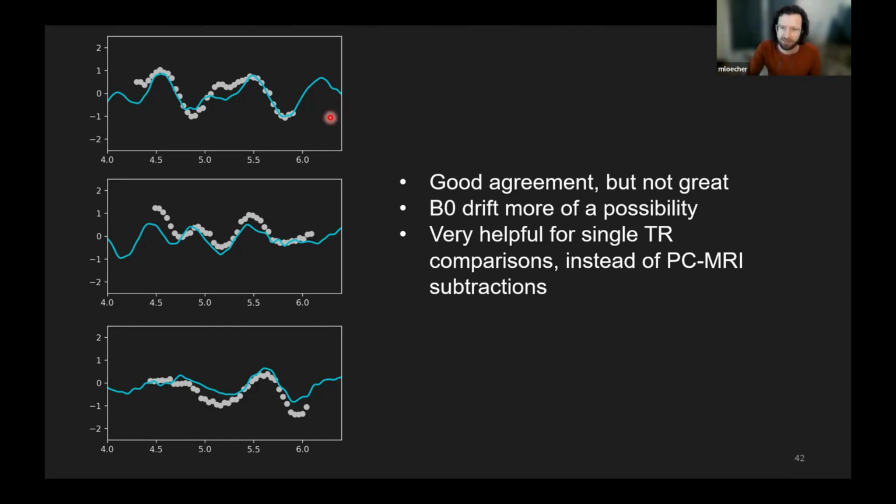It's not drifting in those 5 milliseconds. But currently the way we're set up, I think we can do this better. This Skope measurement, when we measure one TR, we're measuring for one sequence, and then we're waiting for a relaxation and grabbing the next TR, maybe like 5, or maybe it's even like 20 seconds later. I forget how much later, but it allows for some more drift that normally wouldn't happen in a sequence. And so that's probably why it's happening.